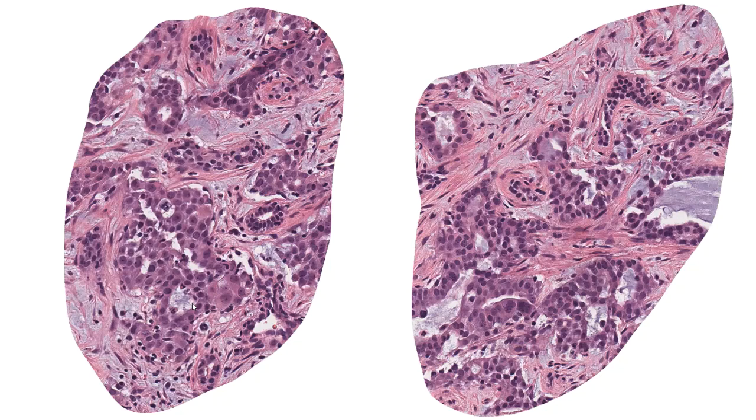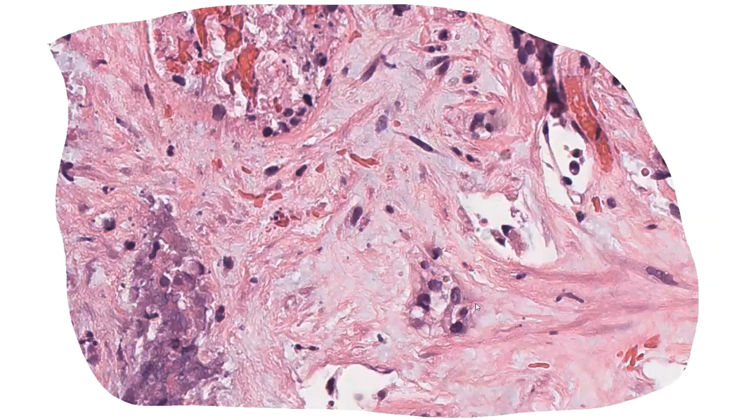Another important thing to keep in mind is that sometimes these cells will have a mucinous element to them. So you see this mucoid element also, which is present in the background within the lumen of these tubules. And these tubules are lined by cells which are atypical. If you look at the background, you will see that there are these extravasated cells, quite a few of which look like sickled RBCs. So that's an important diagnostic clue.